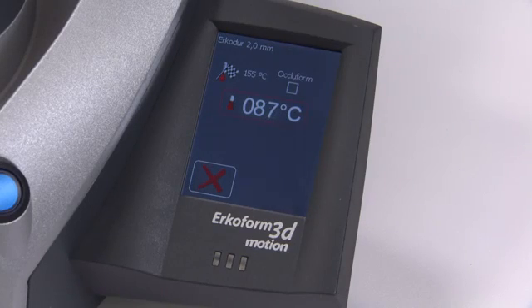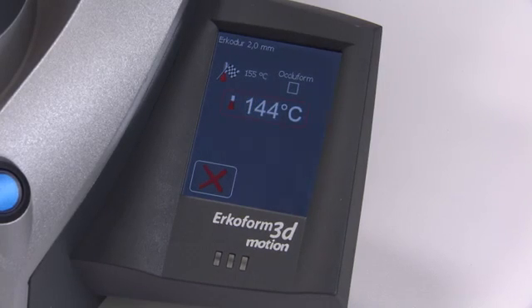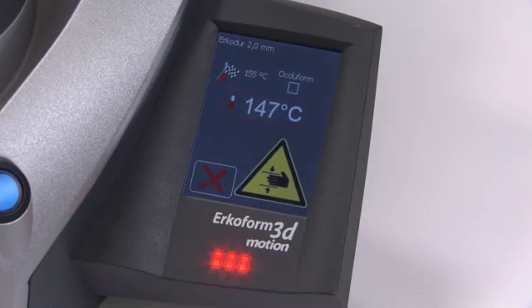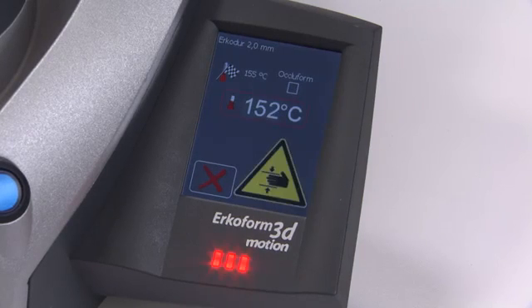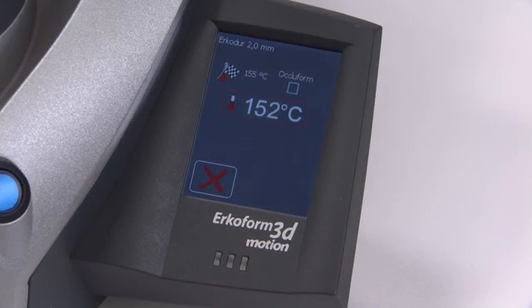When the heating cycle is about halfway through, the vacuum pump will start. When nearing completion of the heating cycle, an audible sound will be heard and a red light on the control panel will flash. A warning to keep your hands free of the Erkoform machine will also be displayed.